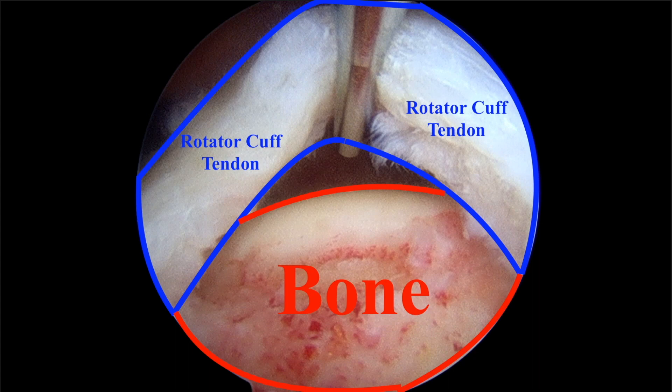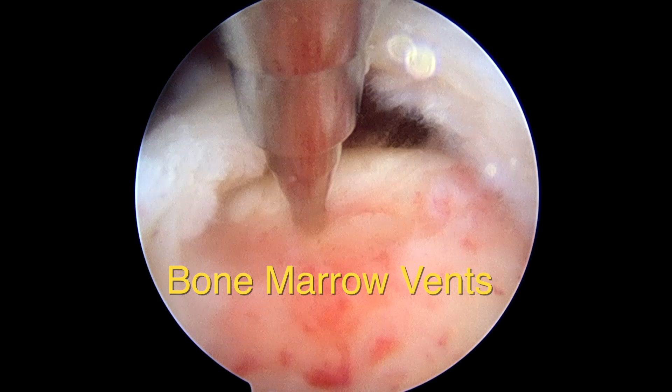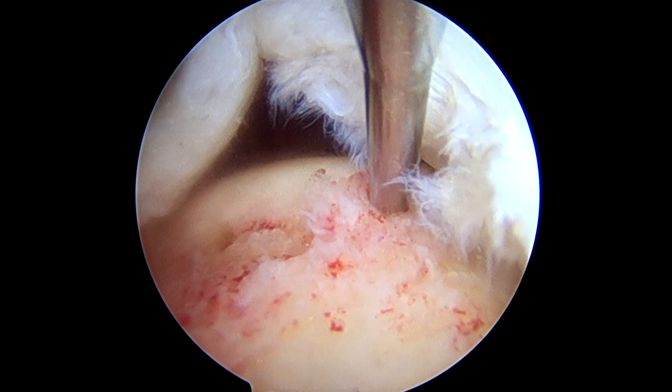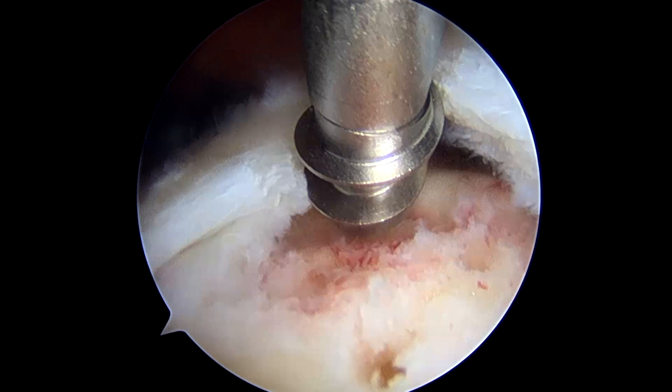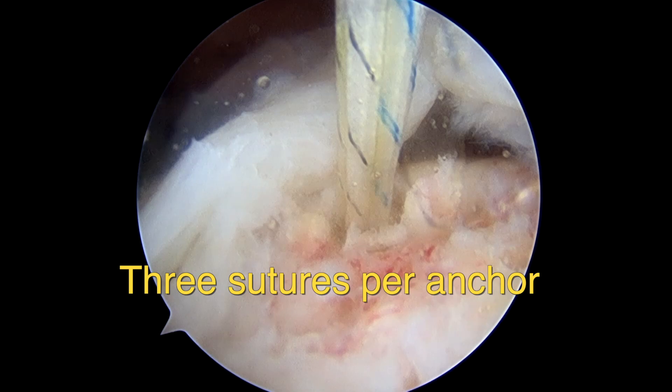By turning the scope around, we see the rotator cuff tear. We've cleaned the edges of the tear with a suction punch, and now we'll create bone marrow vents and anchor bolts. This tear is approximately 2.5 cm, so we'll use two suture anchors with a space of approximately 1.5 cm between the center of each anchor bolt. We insert the first triple-loaded suture anchor near the posterior edge, and the pilot hole is prepared.